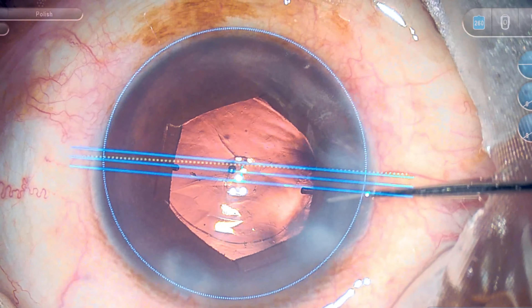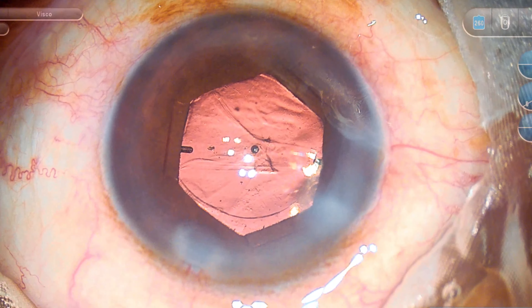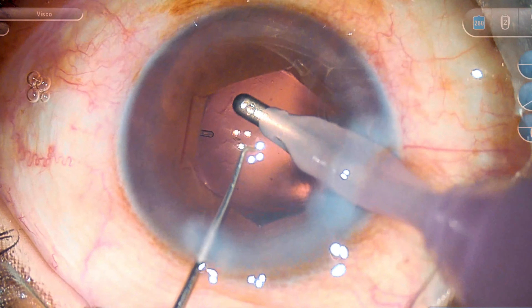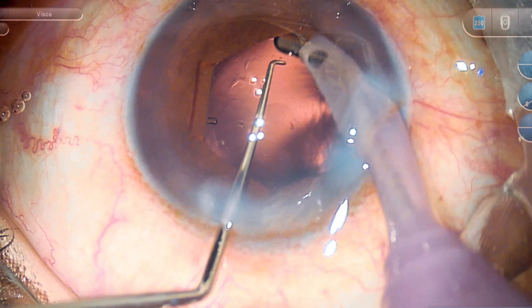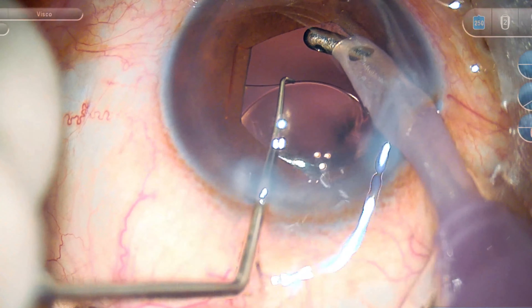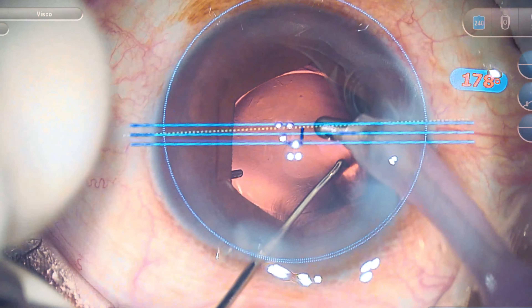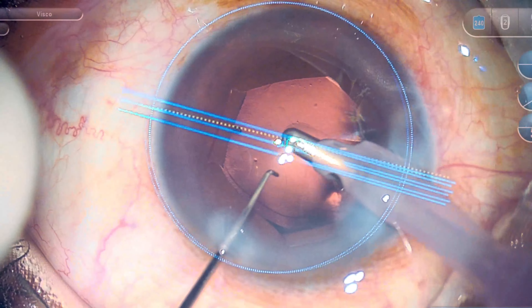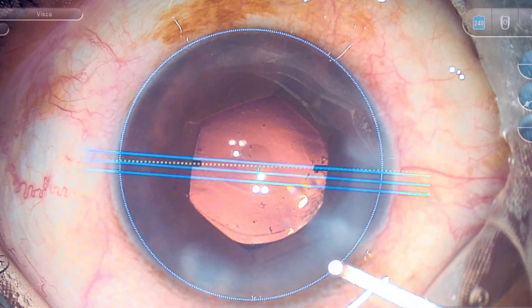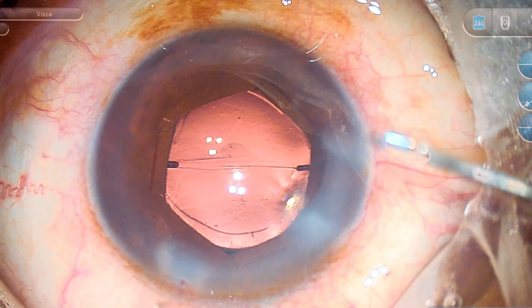The method I employ for removing the B-hex is as follows. First I make sure the IOL is properly in place along the axis. I used 1% hyaluronate cohesive viscoelastic for insertion of the IOL, so it comes out in bulk — I just go to the posterior part behind the IOL and aspirate a bit, and the cohesive viscoelastic comes out quite easily. Once the viscoelastic from the bag is out, I nudge the IOL to the proper axis, and then I inject 1% hyaluronate into the anterior chamber and remove the B-hex.